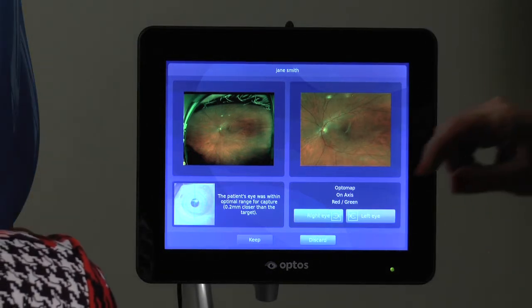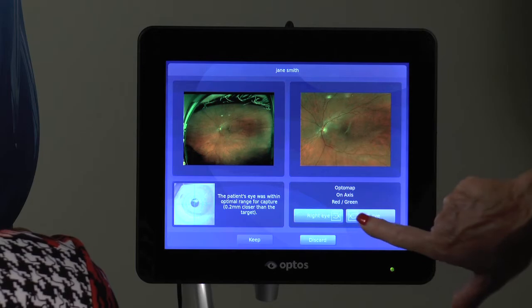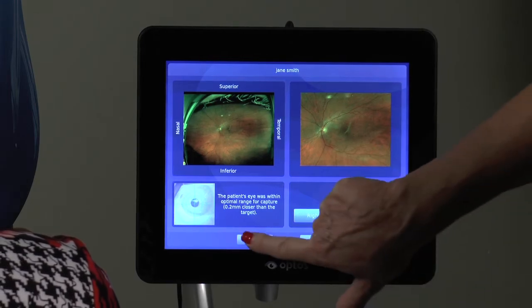If you are satisfied with the captured image, choose right or left eye, then keep.